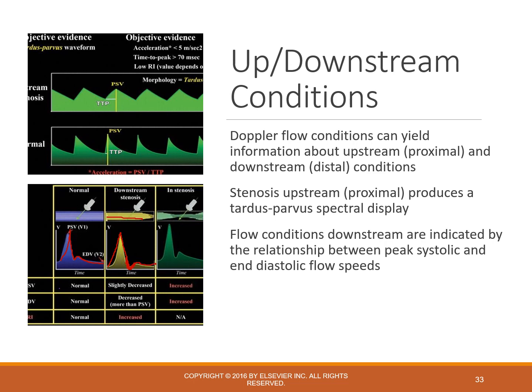So that's saying that it's not totally occluded, it's not a huge resistance, but something's ahead. Now, if this were seen in a high resistance tissue bed like the muscle, I might not think much of it, but if I'm seeing something like this in the liver or kidneys or something of that nature, then that would be concerning.